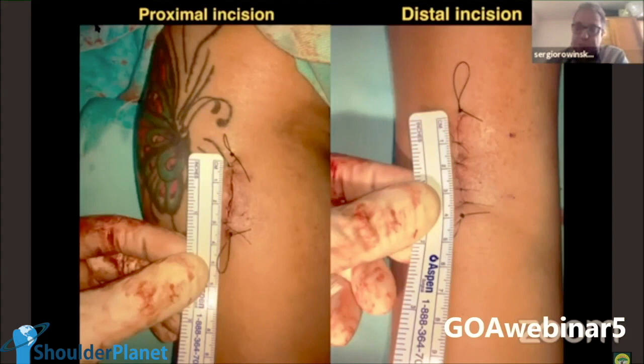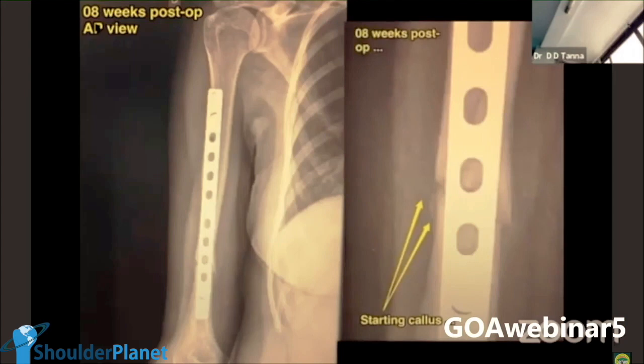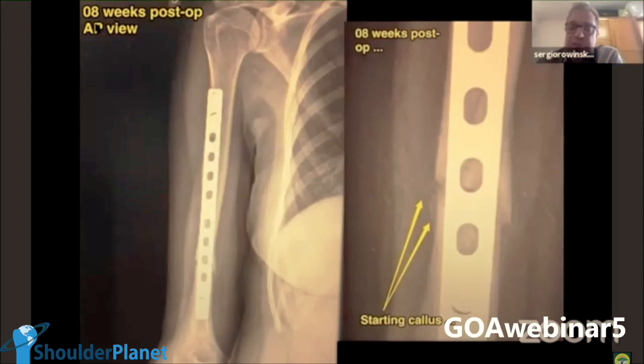What I want people to understand is that there is a very important thing in this technique, something like what Shiva has said: clinical healing precedes radiographical healing, and this is very important. Clinical healing precedes radiographical healing a lot, and I'm going to show you beautiful examples. So when does the callus start? I would say the literature is very clear, from 12 to 16 weeks, but you can have less or you can have more, and I'm going to show both cases.